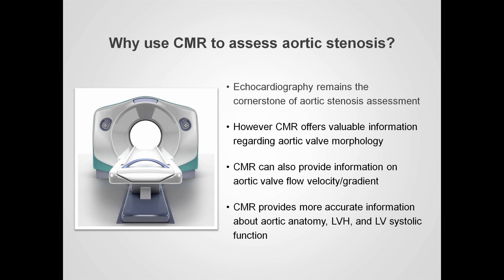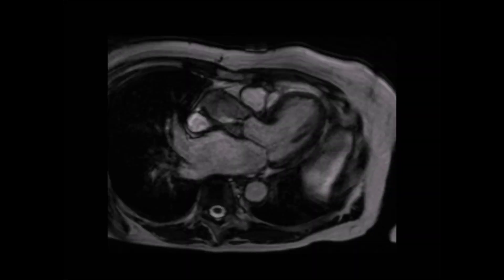So let's take a look at some examples, beginning with the assessment of valve morphology. This is a still frame from a Cine-CMR image — a three-chamber view with the left ventricle, the mitral valve, and the left atrium. We have the left ventricular outflow tract, the aortic valve, and the aortic root. In this view we can inspect the aortic valve cusps, and as in the echocardiographic parasternal long axis view, we have the right coronary cusp and the non-coronary cusp.